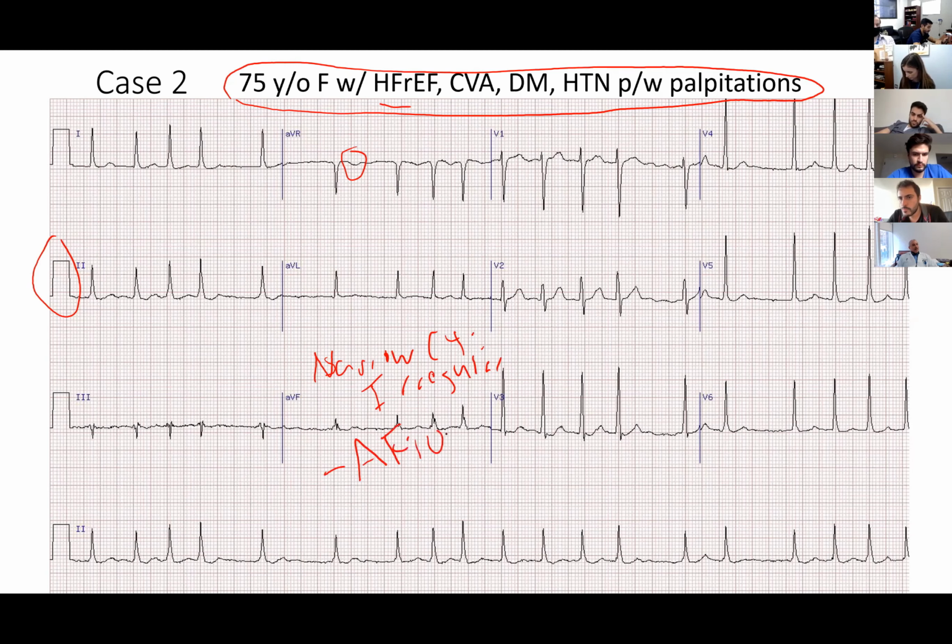Then think about multifocal atrial tachycardia. Usually in the Steps, it will present as a COPD exacerbation who is hypoxemic, and they do an EKG, and you see 3 or more P-wave morphologies, right? Then you're going to think about sinus rhythm with PACs.